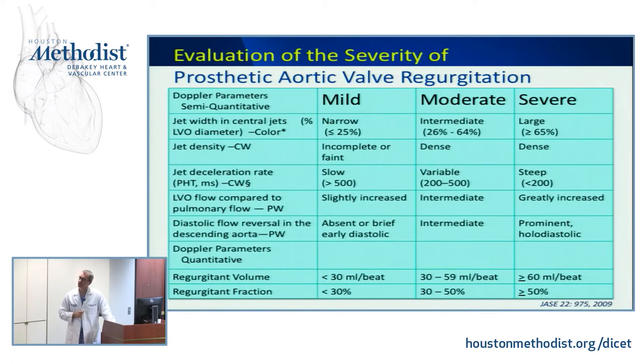Okay. And then we have a similar approach, this is in the guidelines. It really is exactly the same as what we propose for native valves. So there's no new hemodynamic criteria for prosthetic valves that aren't already there for native valves. And the PVL is the unique element.